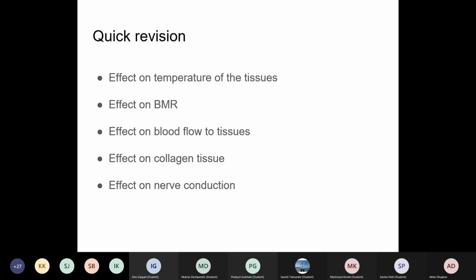Blood flow. That is blood. You have got extracellular and intracellular fluid as well. So there are many sources for heat transfer over here. You remember that when you place your hand across the electrodes, you start feeling a mild warmth. Even that much warmth is enough for you to get this temperature change over here, and so you are going to get a lot of conduction and convection happening within the tissues.